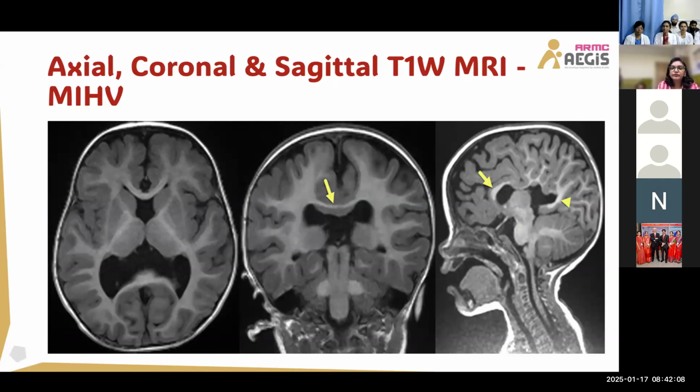Yes. Yes. For us, you initially showed a sweep, a coronal sweep, no? Yes. So that you'll be able to show clearly. Yeah.